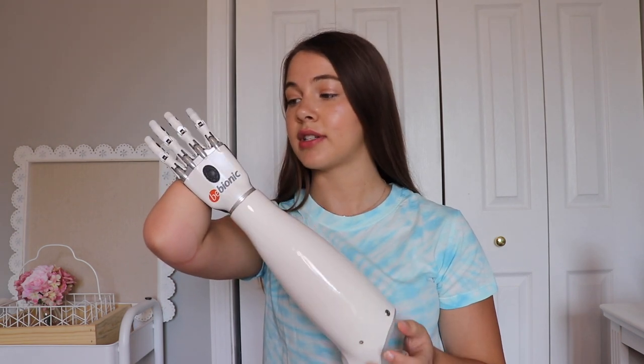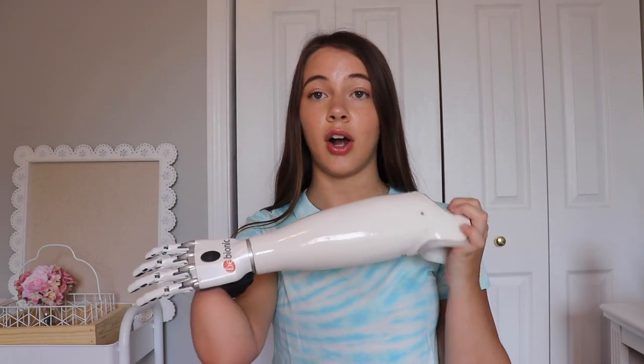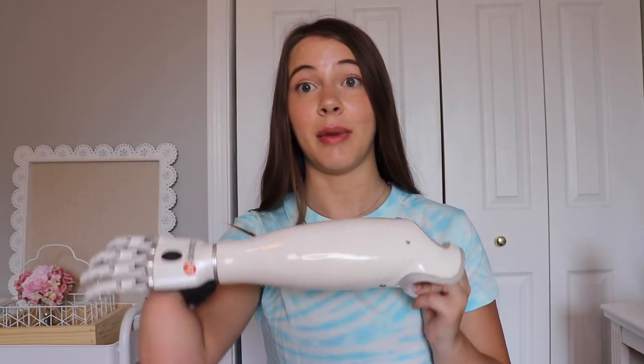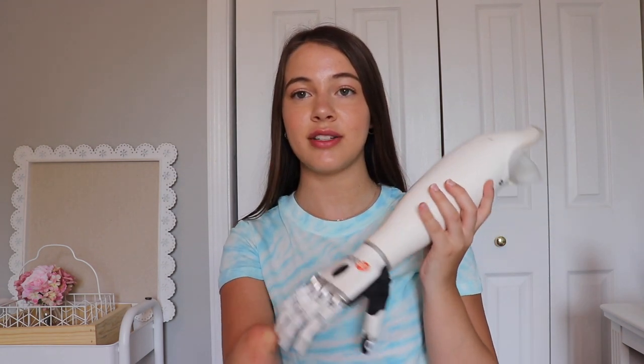I was able to get my prosthetic arm through a place called Hanger Clinic. They specialize in prosthetics — both arms and legs — and they also sell a lot of braces that help people. The process for getting this arm actually took a lot longer than I expected. I was hoping I would get it by the end of the month, but it ended up being a few months. At my first appointment, they molded my arm to get the shape and size of what the prosthetic arm needed to be for the socket. I also told them certain parts of my arm I don't really like pressed, so I wanted to make sure there was a little bit of room in the prosthetic arm so it wasn't pressing against that part.